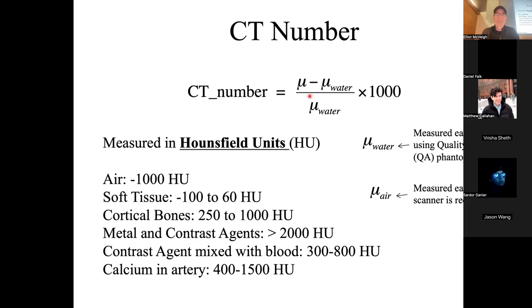And so they needed to encode the image as integers, and ideally 8-bit integers or maybe 10-bit integers, something like that. And the mu values, as you saw from the NIST table, are floating point numbers to 16 digits, right? So we need to map to a better system for putting numbers on a screen in the 70s, right?